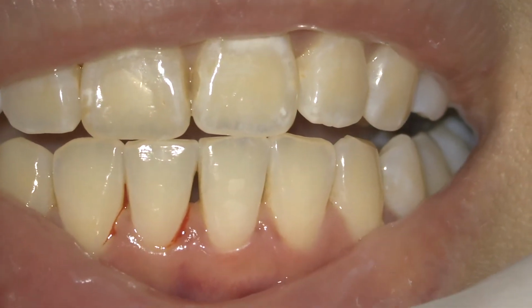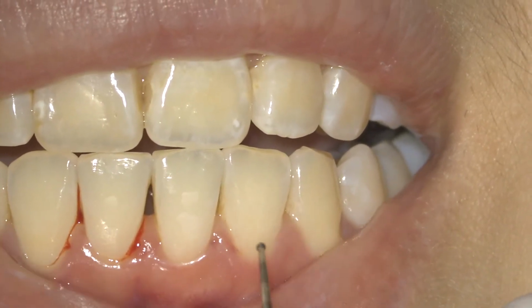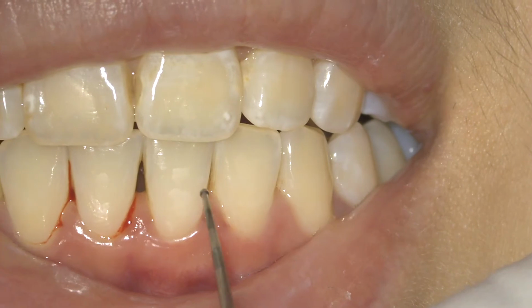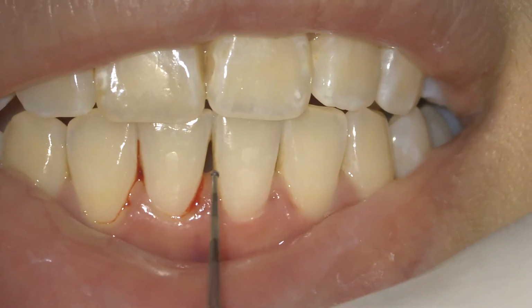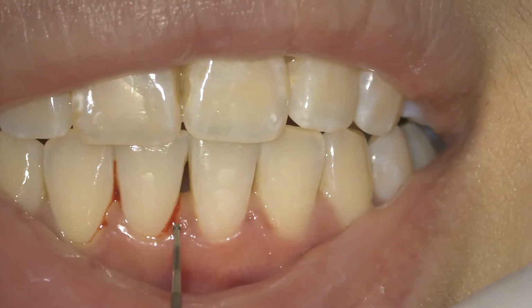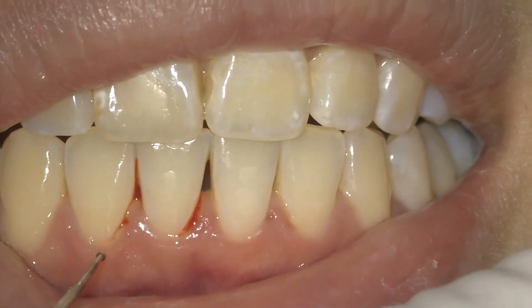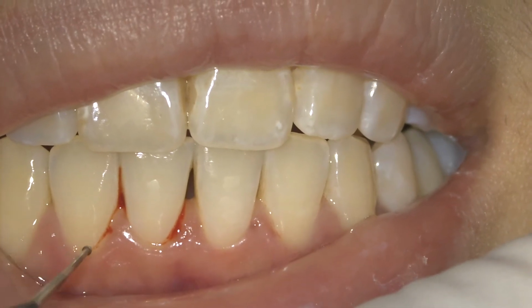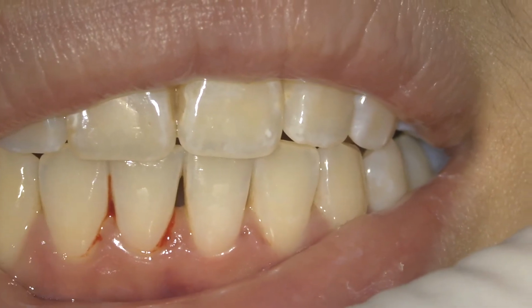But you can see, for example, in this area, you cannot really appreciate any bleeding as of now. Maybe as you wait, it may come up as a bleeding spot. But if there is no bleeding spot observed, it could be a score of 0. Here, there is an isolated bleeding point only in one area. So this could be a score of 1. Here, you can see 2 bleeding points, right? So if multiple bleeding points are present, too many, then we can give a score of 2. But in this case, I believe it can still be a score of 1 because it's too few to consider score 2.